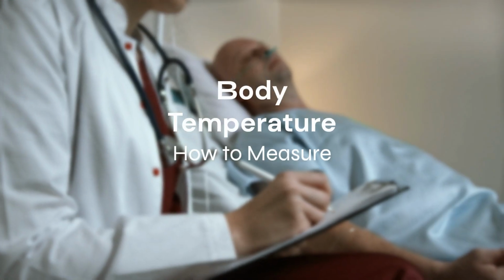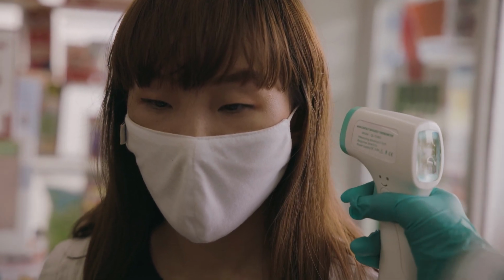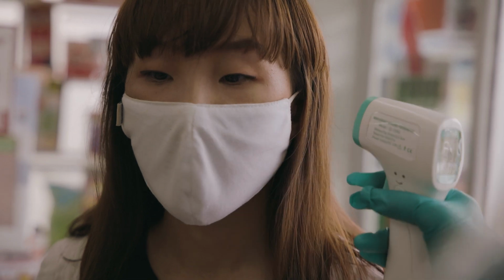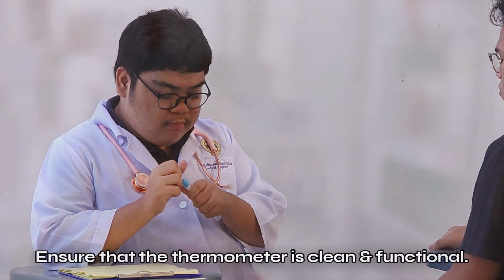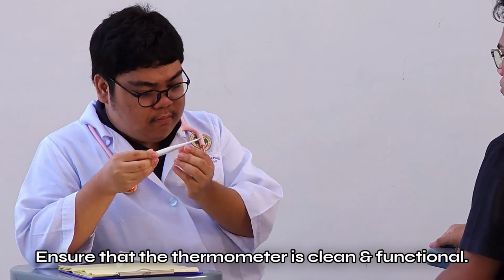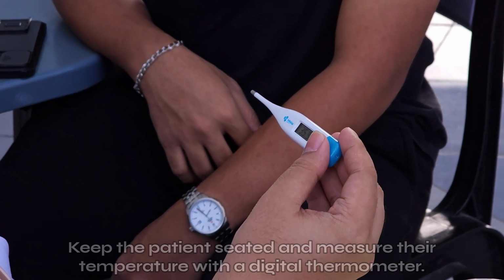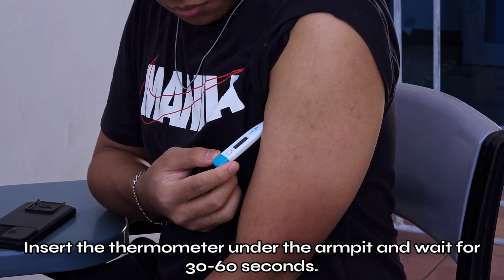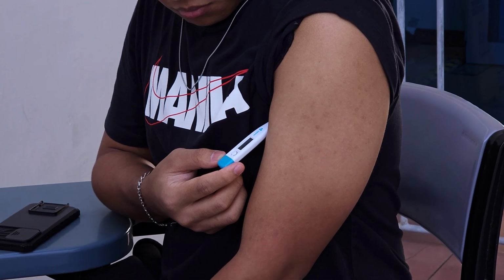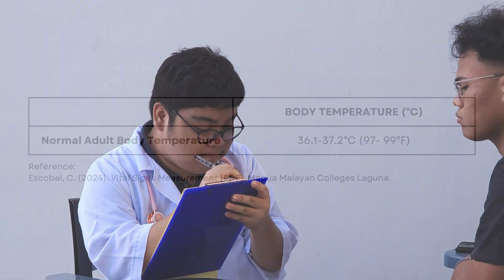The body temperature is the measure of the body's internal temperature. It can vary depending on the person's biological sex, food and fluid consumption, time of day, and stage of menstrual cycle in women. To get the body temperature, ensure that the thermometer is clean and functional. Place the student in a comfortable seated position. Measure axillary temperature by using a digital thermometer. Insert the thermometer under the armpit and leave it in place until it beeps. This usually takes around 30 to 60 seconds. Record the temperature.